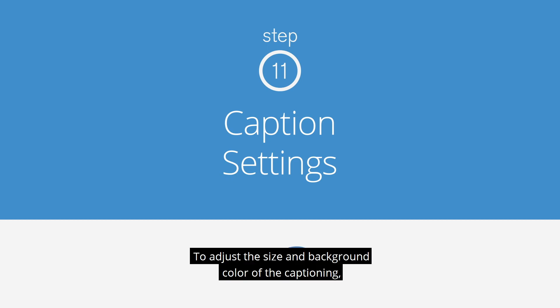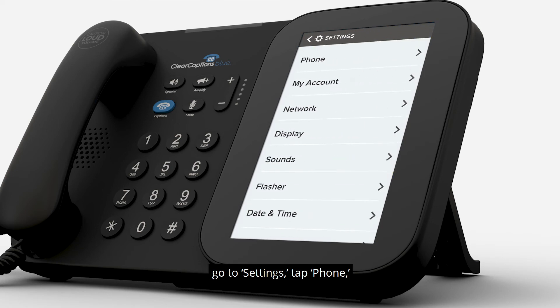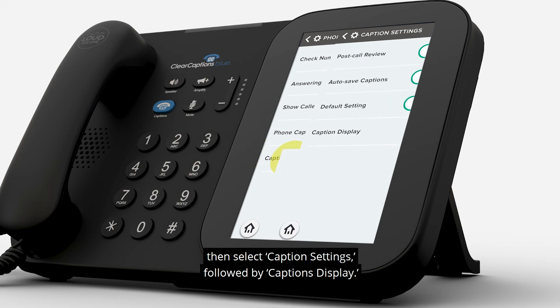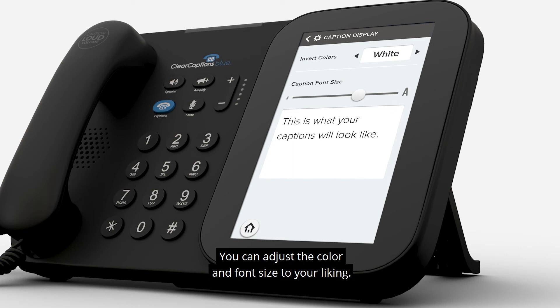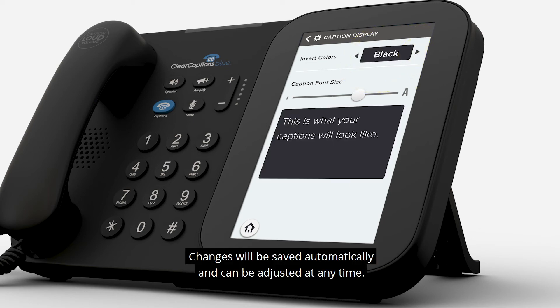To adjust the size and background color of the captioning, go to Settings, tap Phone, then select Caption Settings, followed by Captions Display. You can adjust the color and font size to your liking. Invert color options include black captions on a white background or white captions on a black background. Changes will be saved automatically and can be adjusted at any time.